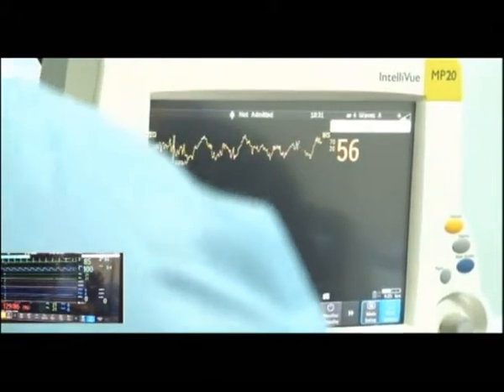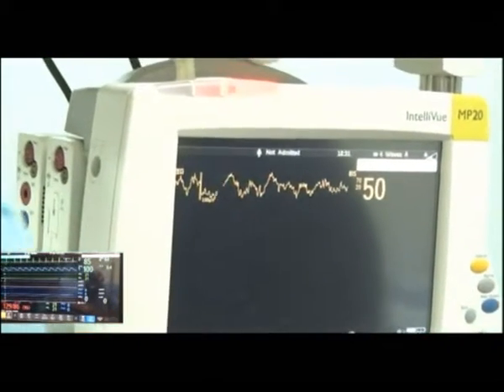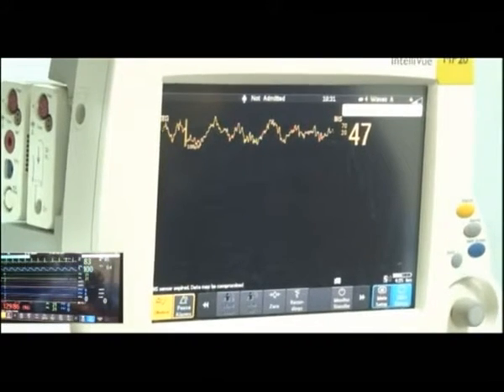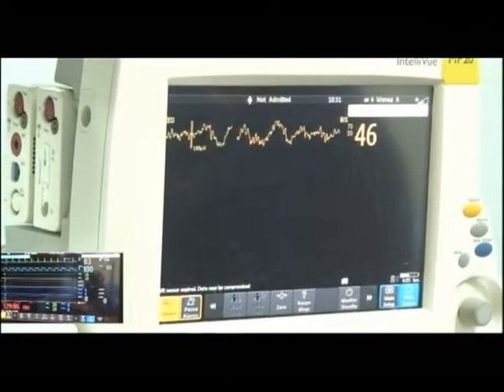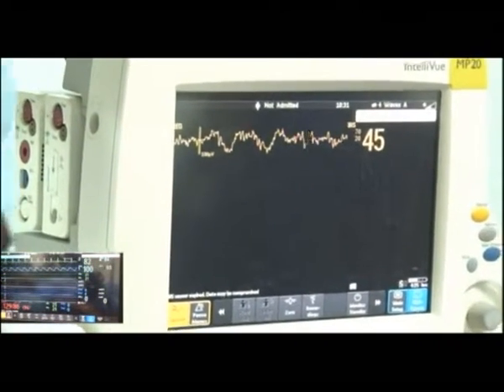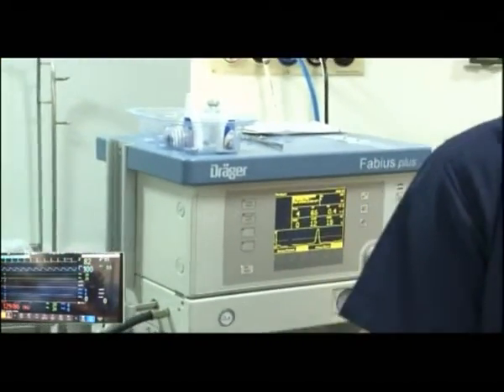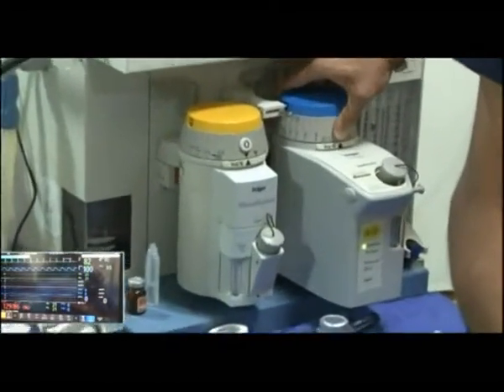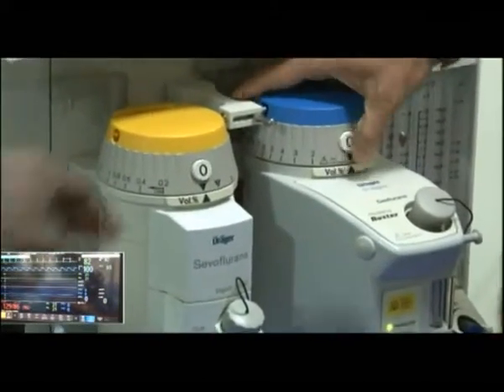And then what you do is once... Go ahead. 25, 30 milligrams is fine, that's good. And then we are going to have a dial concentration of desflurane at 3%. So you want to turn the dial concentration of desflurane to 3%.